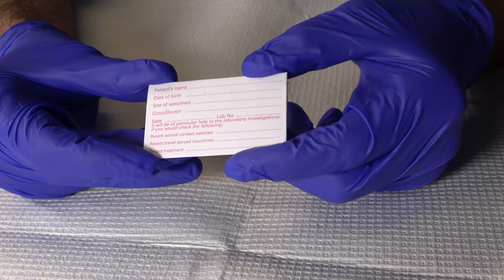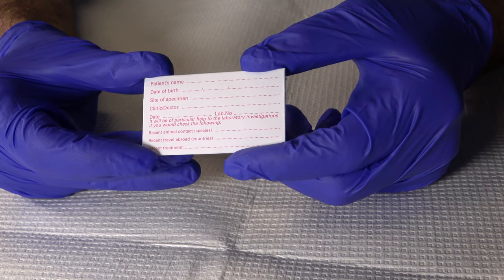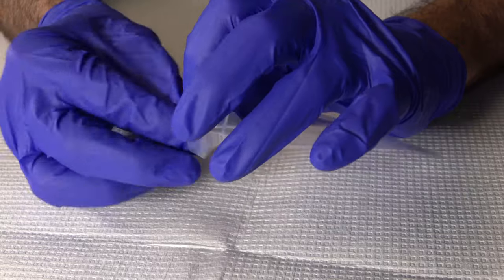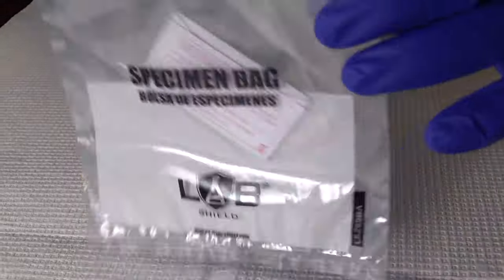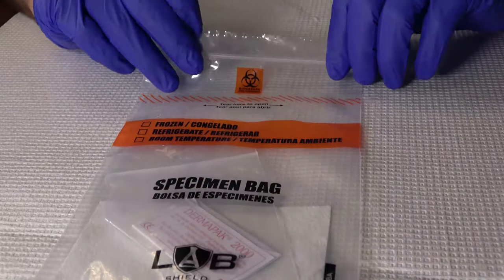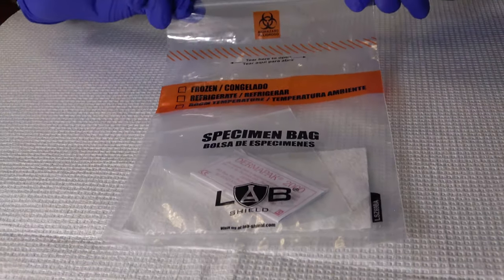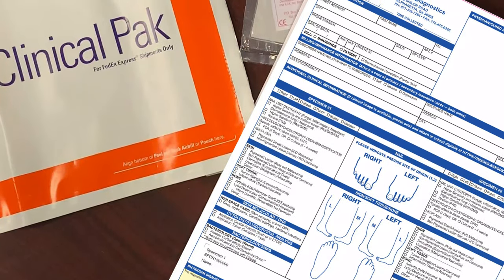Complete the patient information on the rear panel and insert the collection pack back into a resealable plastic bag. Now place the resealable plastic bag inside the biohazard bag and seal. Fold the completed requisition form and place it in the outside pocket of the biohazard bag.